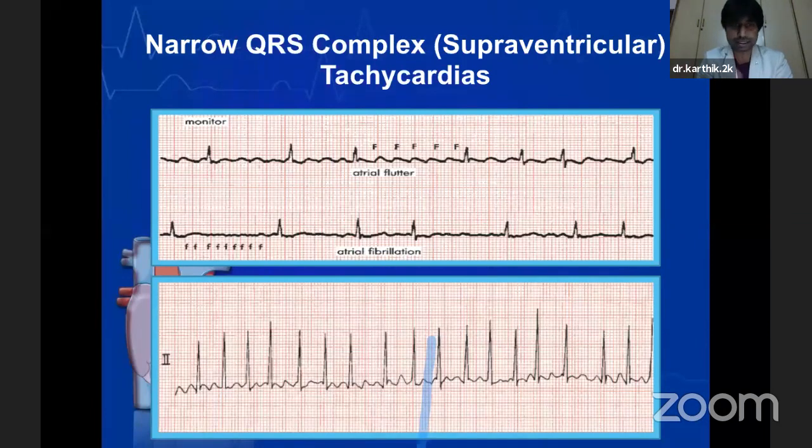In the next illustration, we can see again it is a narrow QRS complex tachycardia. The RR interval is varying. The heart rate is very fast. If you employ the conventional techniques, you can see that the heart rate is close to 180, 190. And as a beginner, sometimes you may have a confusion to discriminate between whether it is a regular RR interval tachycardia or an irregular RR interval tachycardia. But if you see closely, definitely there is irregularity between the RR intervals.